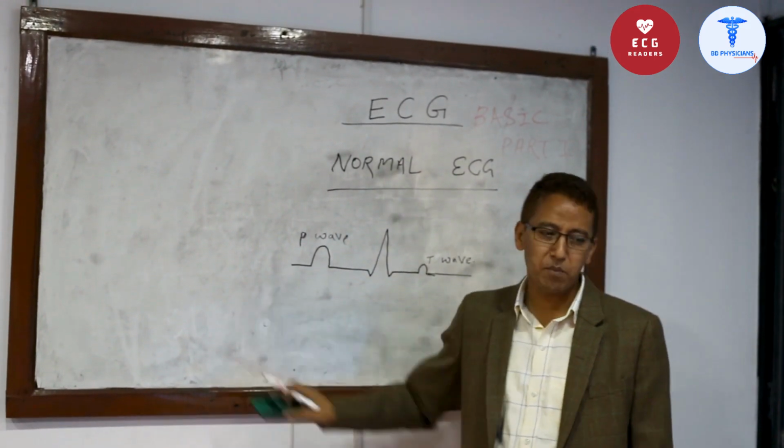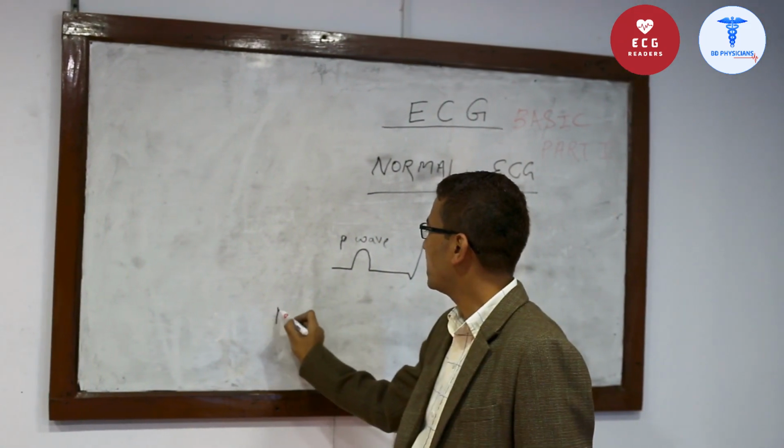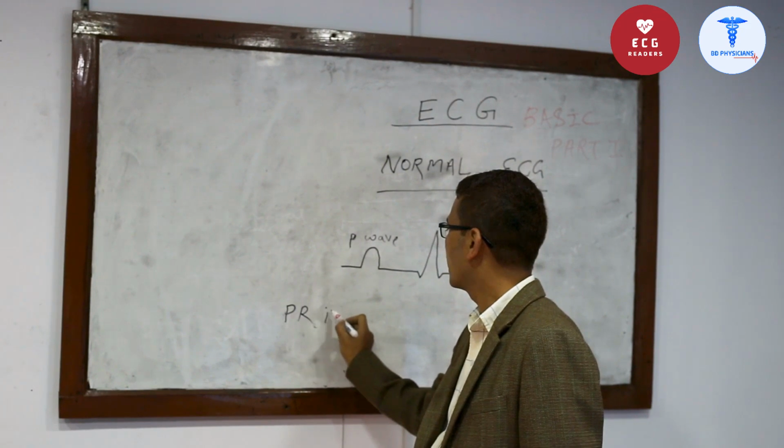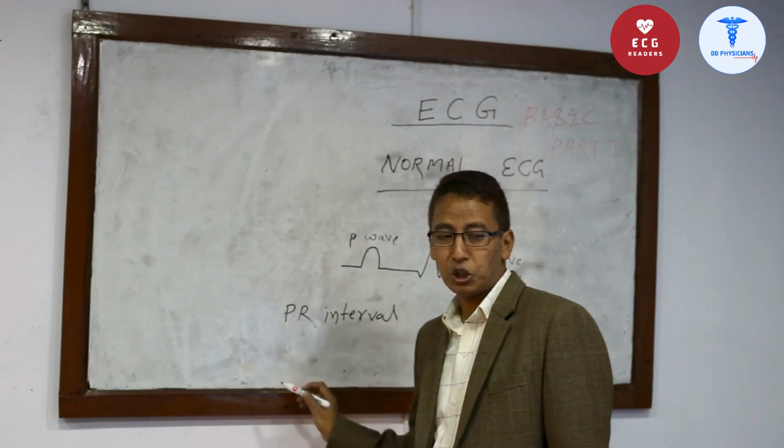We should know some normal intervals also. Normal intervals like the PR interval and QT interval.